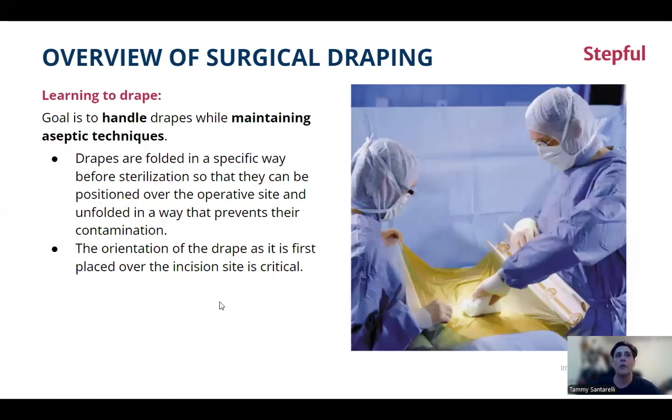Goal is to handle drapes while maintaining aseptic technique. So you got to remember that your playing field is from your neck to your abdomen. That's where your hands always need to be, neck to abdomen. They can't go above, out, or down below your waistline.